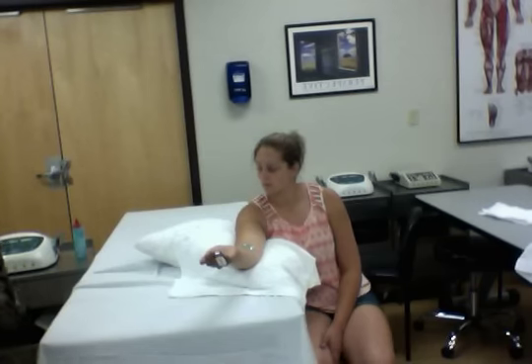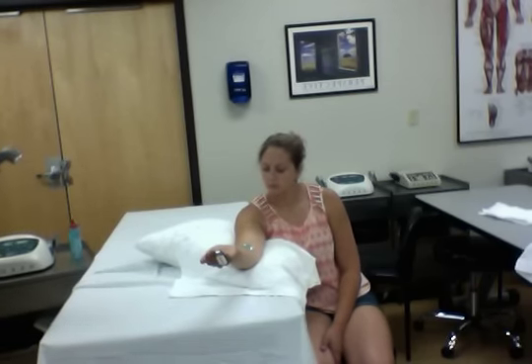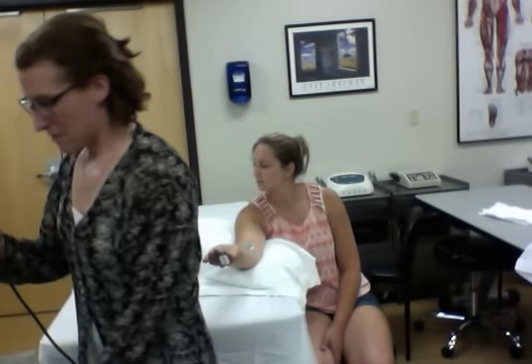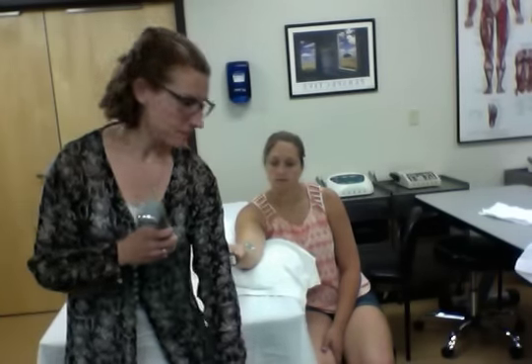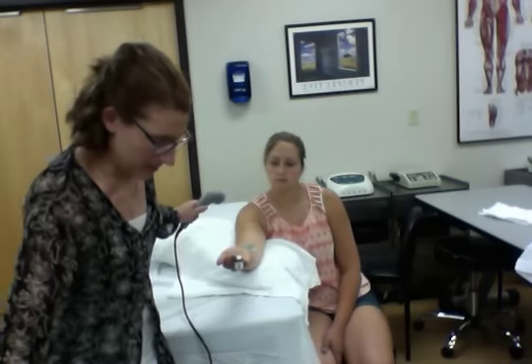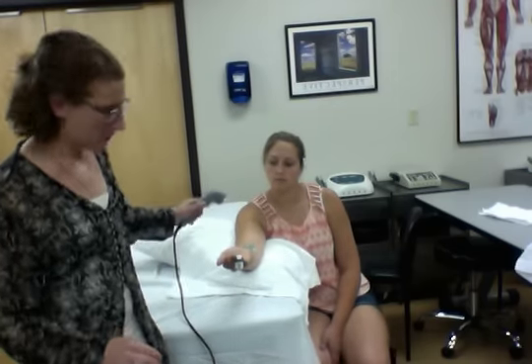So now the one thing I need to fix before I begin is I need to be able to touch my machine and take care of JC at the same time. So I'm going to go ahead and move my machine around so that now I can see my machine right here in front of me and I can see JC. A little further if I can.